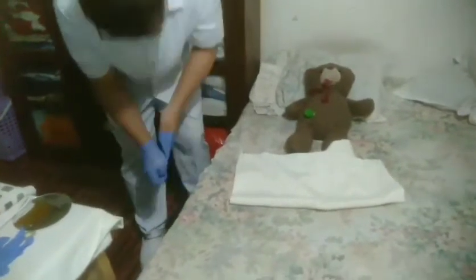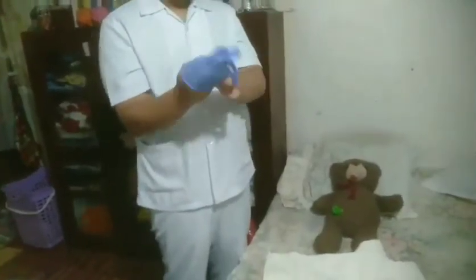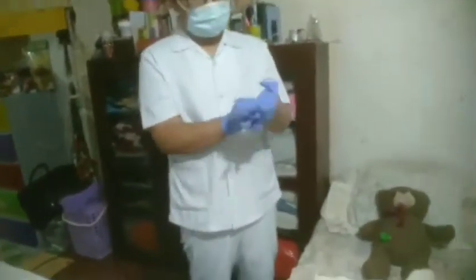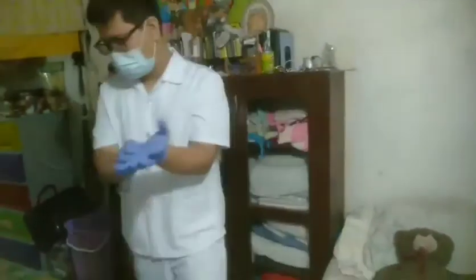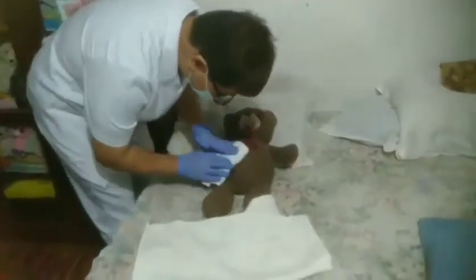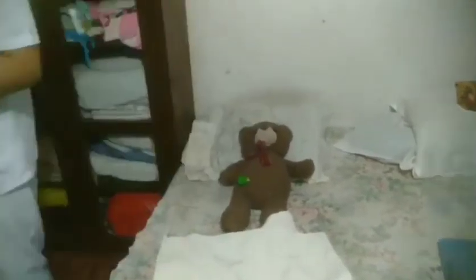Okay, and then assist now the client in drying the peristomal skin and stoma. Now use the toilet tissue to remove excess stool after you have re-gloved. Okay, use warm water and mild soap. The mild soap is optional. Okay, and cotton balls or washcloth, you can use a washcloth to clean the skin and the stoma.